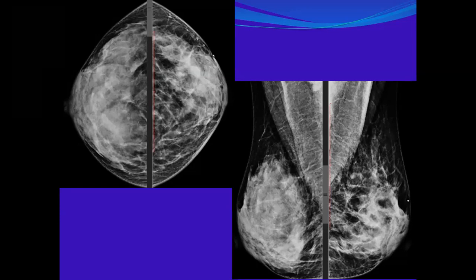If it is not available, you have no previous. You have not the patient to ask about. You did not find history. Okay. So I will make it as BIRAD 0. I have to recall the patient. Yes. And I cannot diagnose it as global asymmetry without any, and I have it for further assessment.